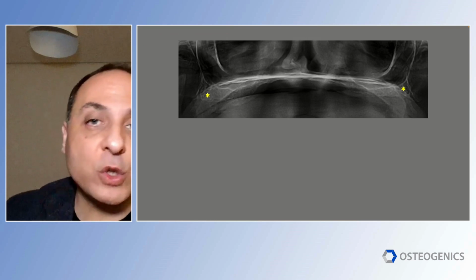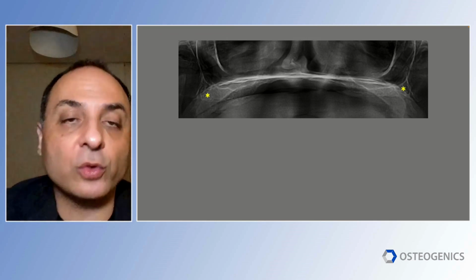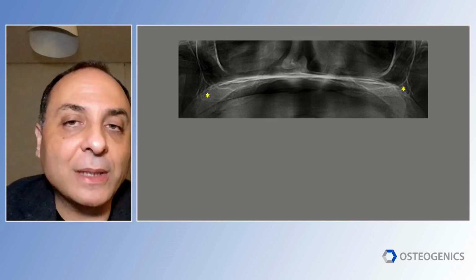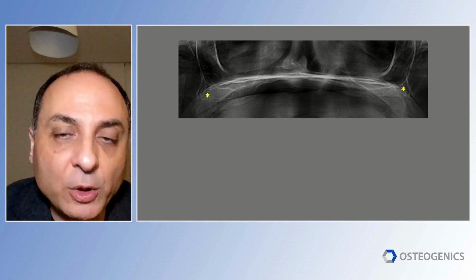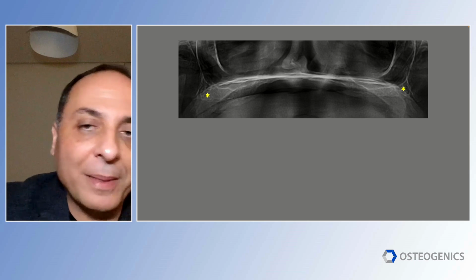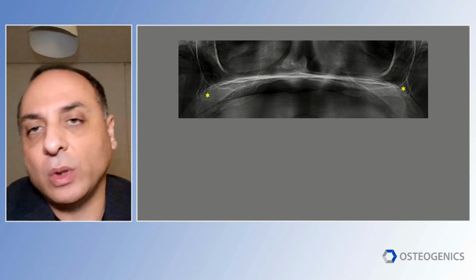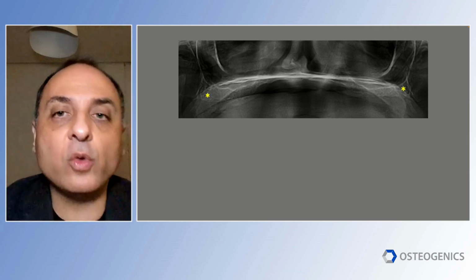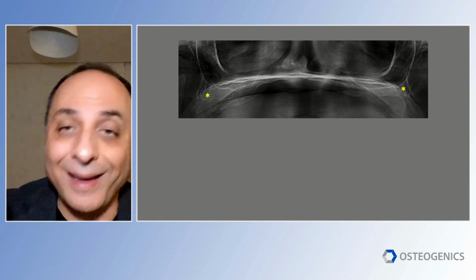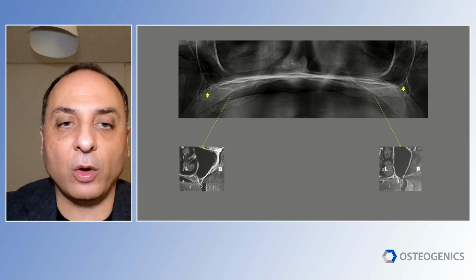So I'm going to finish with two cases. This is the extremely atrophic maxilla. This is a new indication for the ridge augmentation. A very interesting indication, because the extremely atrophic maxilla is a chapter on its own in ridge augmentation, and usually it was treated by hip graft, by maxillofacial surgeons, calvarial bone, zygoma implants, so very invasive surgeries. So if you want to treat your patient by GBR without using any gram of autogenous bone, it's possible. So this is the protocol that I follow.